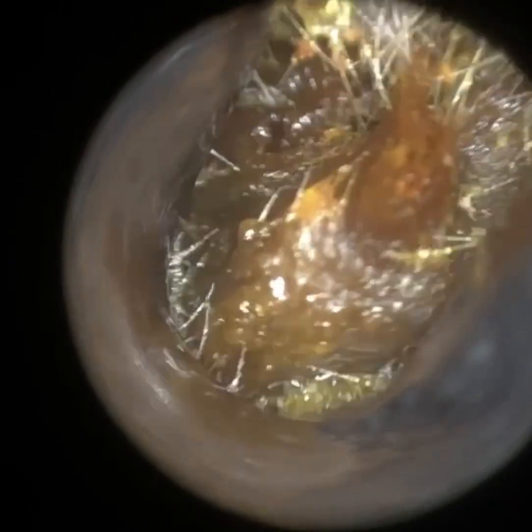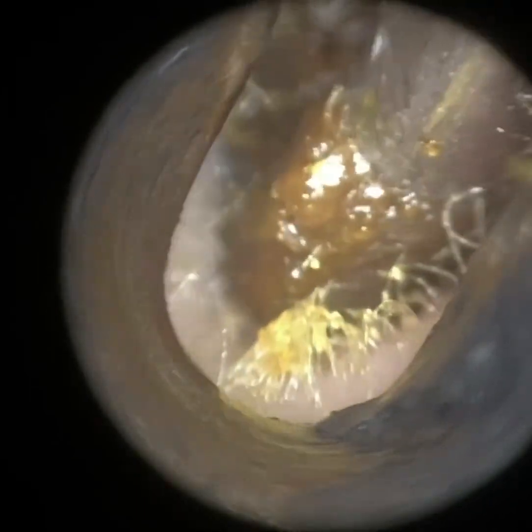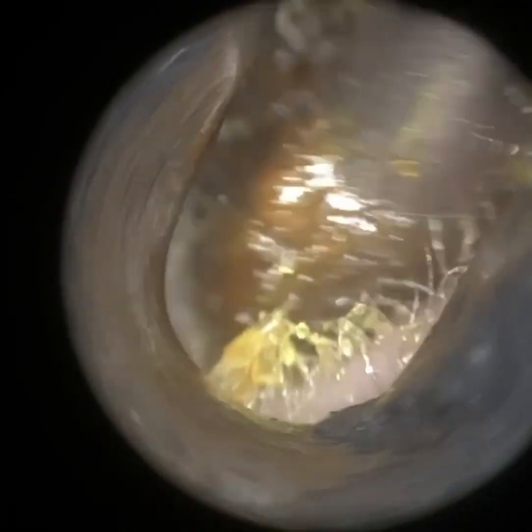You can see I'm just bringing this forward where the first bend is just to the right there. I'm going to stretch the ear open again just because it had a very narrow entrance — keeping ajar the first bend and trying to just bring this through. I'm using this rocking motion, getting a suction grip, and just wriggling this left to right.